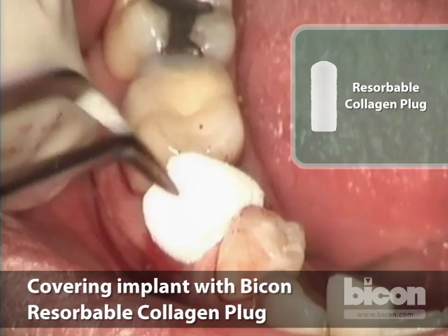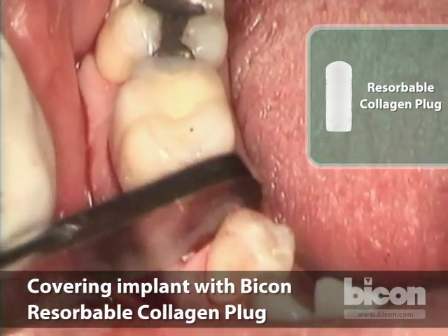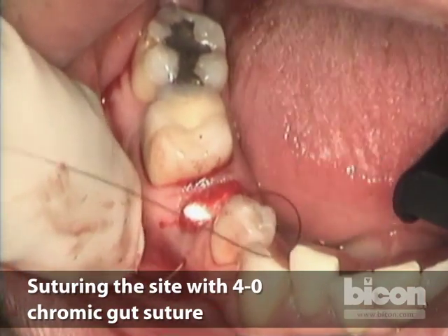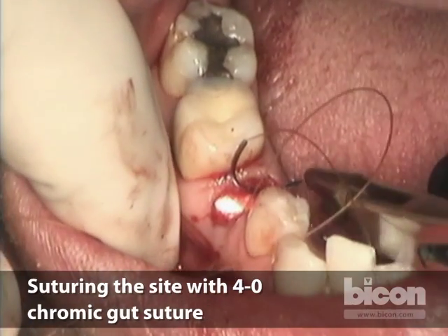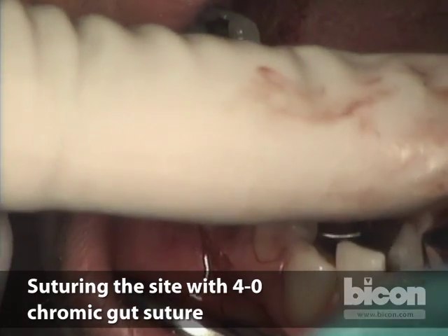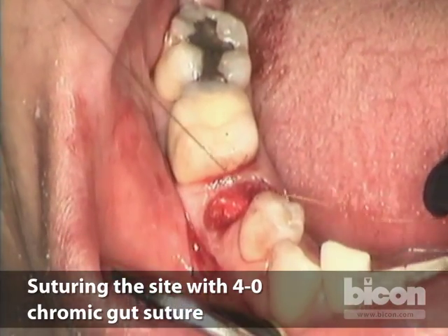We use a 4-0 chromic gut suture. We use an inverted figure-of-eight suture, or a crossed-over horizontal mattress. We go from the rim of the soft tissue on the mesial buccal to the rim of the soft tissue on the distal lingual, then to the mesial lingual — almost like a horizontal mattress but crossing over. This holds the plug down and in place and acts almost like a purse-string suture for the rim of the socket.